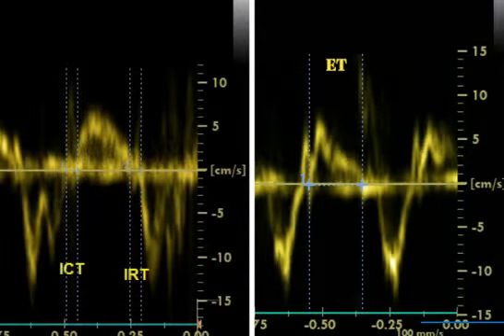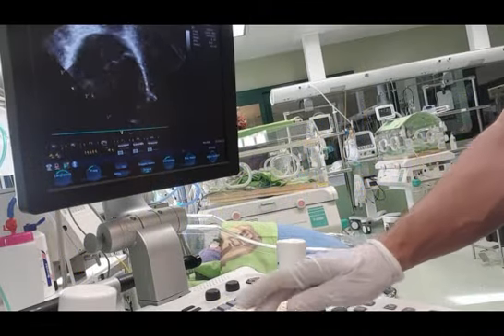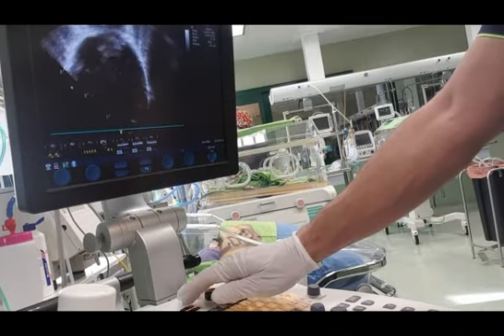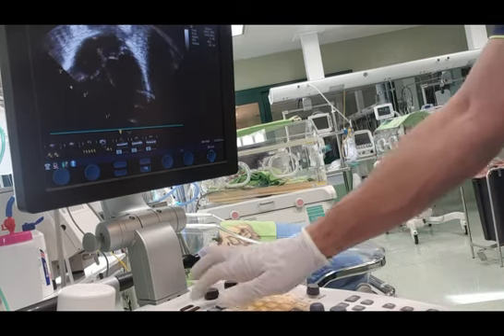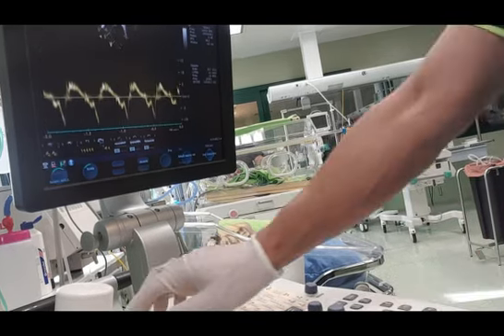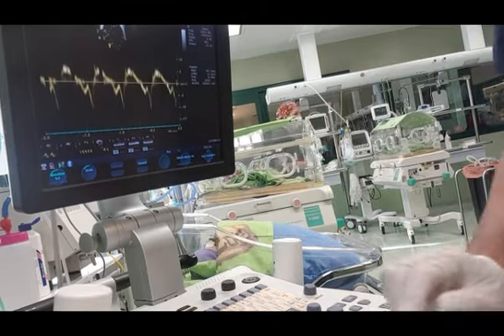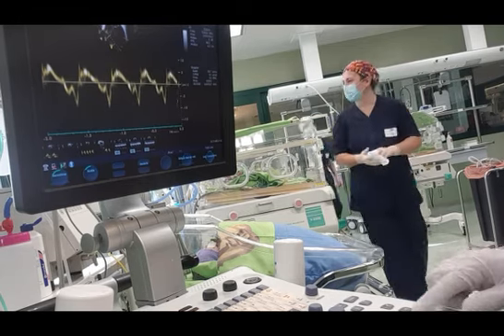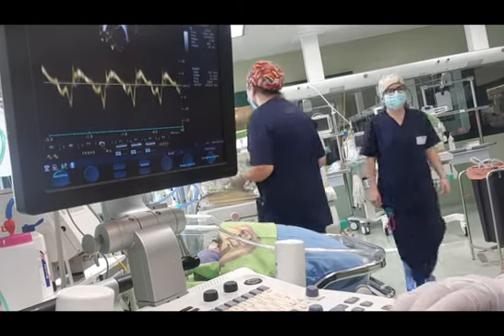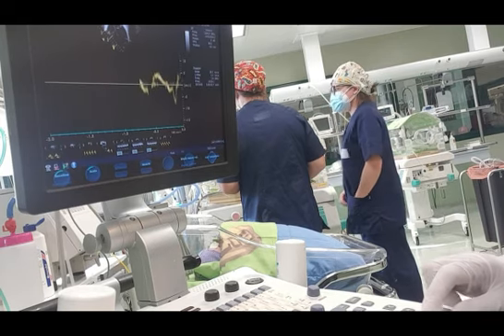Myocardial performance index represents the relation between the sum of isovolumic contraction and relaxation time and ejection time, and can be derived from tissue Doppler, both color and pulsed-wave. This index is a non-geometric index and can be considered independent of loading conditions. It is generally used to estimate global ventricular function of the left ventricle, but the application in the pediatric and neonatal population for right ventricular performance is widely accepted.